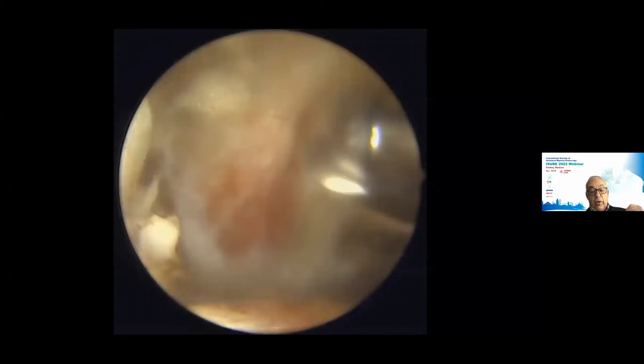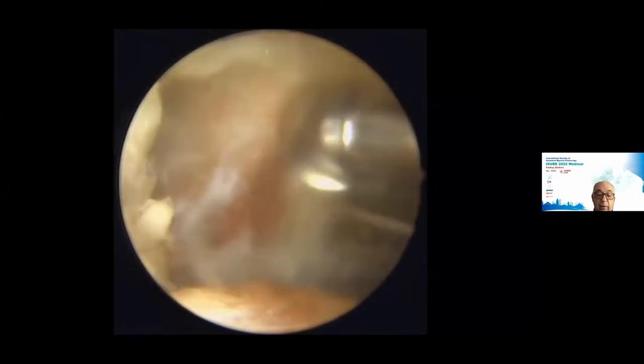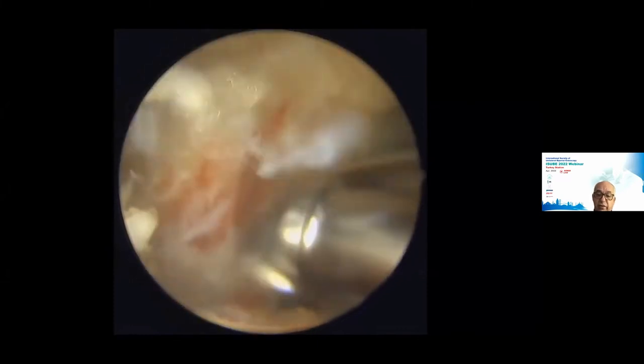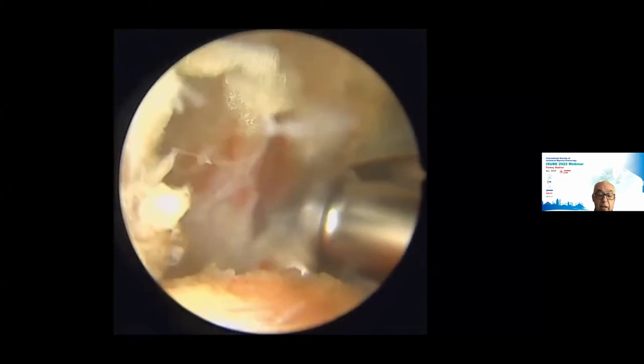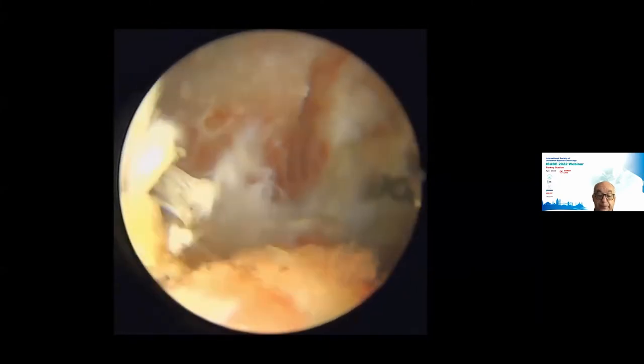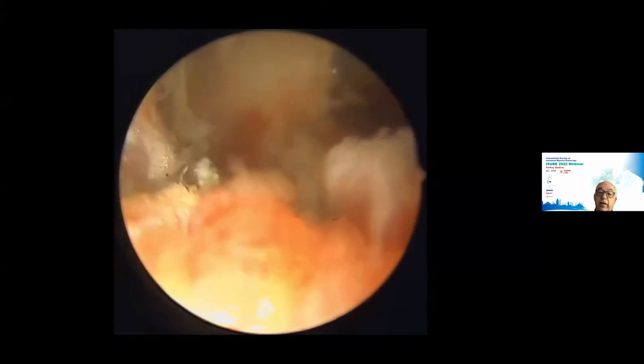But before this, when we have a good view of the lamina and the spinous process, we will start to drill the lamina with a shaver. I use a shaver of 4 or 5 millimeters. We are drilling, and with the Kerrison, we take the medial part of the lamina and also a little part of the superior articular process. Then, with a hook, we open the ligament, and with the Kerrison, we remove until the canal is decompressed.